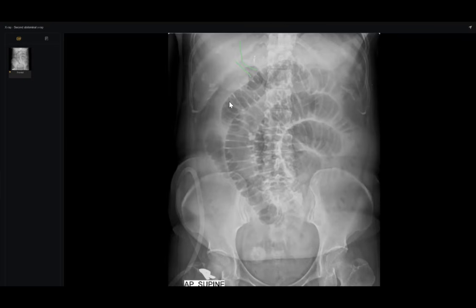And by the way, my colleagues, zooming is allowed without permission in the Viva. Don't ask the examiner. He becomes very happy when you are zooming. Why? Because zooming means this is your actual practice. So you must zoom first, or ask me, because we didn't have a tool here to zoom.